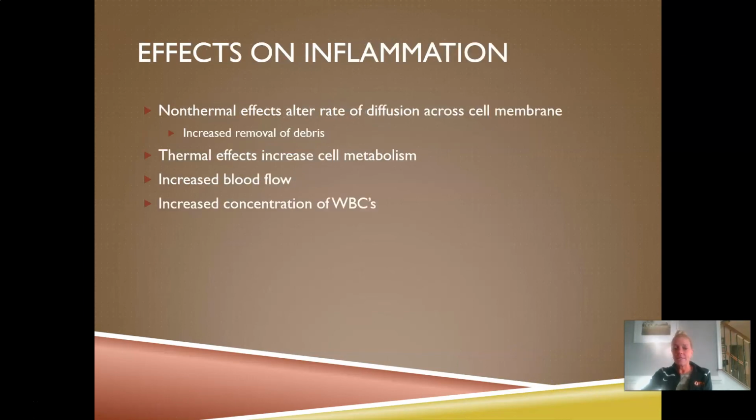As far as the effects on inflammation, non-thermal effects are going to change the rate of diffusion across cell membranes, so it's going to alter cell membrane permeability, help to increase the removal of debris. Thermal effects are going to have all the same thermal effects that we've already discussed, including increasing cellular metabolism, increasing blood flow, and with increased blood flow, you'll have an increased concentration of white blood cells to the area, which can help with healing.